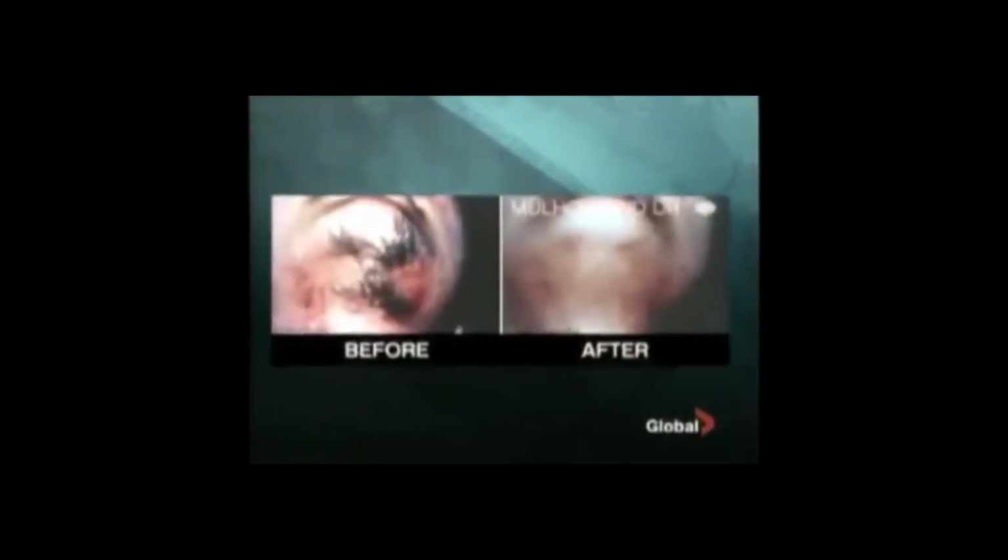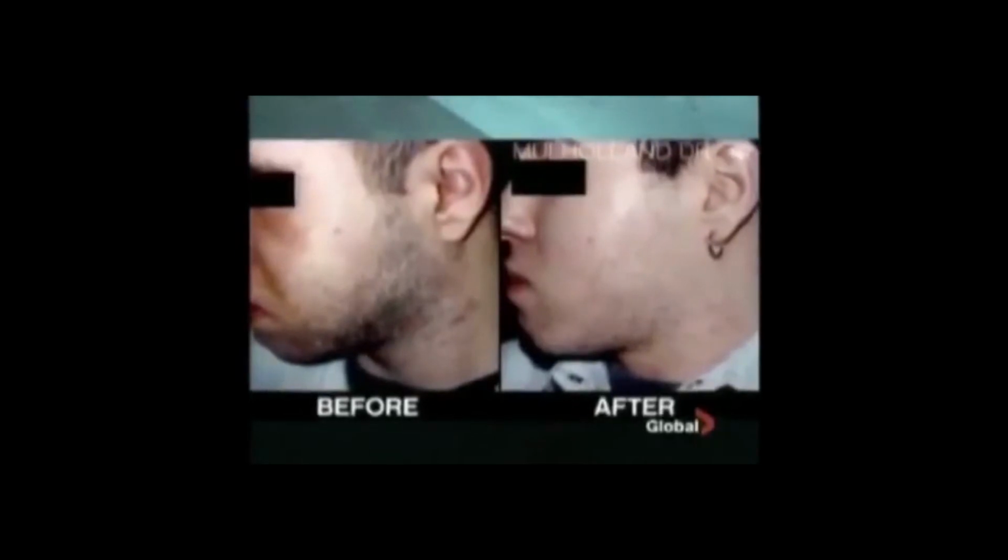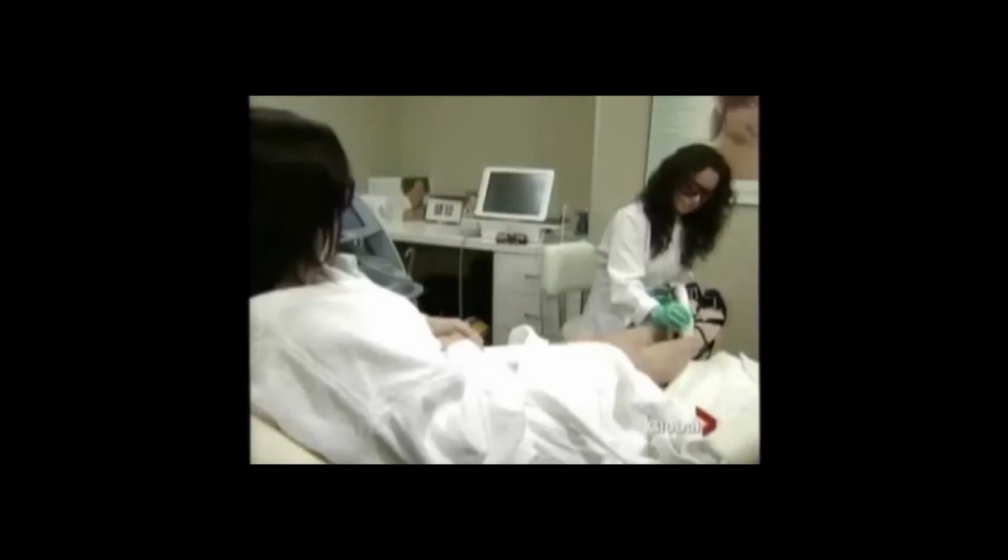But in the short term, more than shaving and more than waxes, things you have to keep doing to keep the hair away. One hitch with lasers, you need dark pigment in your hair. Other disadvantages, if you are gray, blonde, or white-haired, you're out of luck. We need a target, we need a color for that laser wavelength to be attracted to.